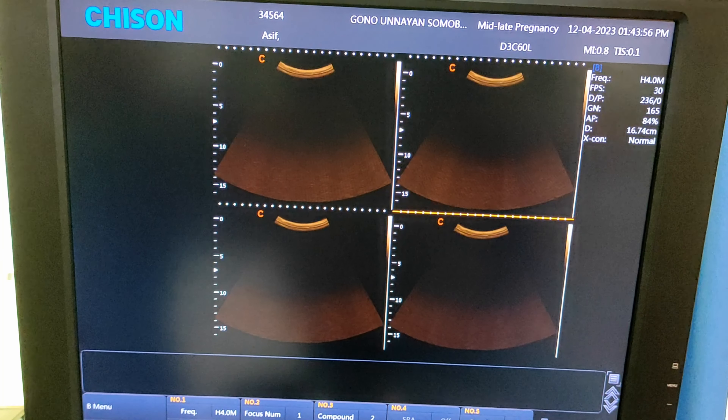This one is the M button, or M-mode — cardiac mode. Press it and this will show you one cardiac indicator, or heart rate measuring indicator, on your screen.